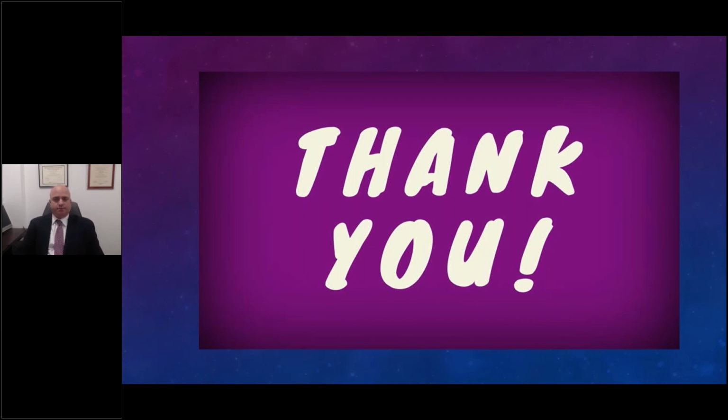Thank you. The next one is, do you have 25 millimeter available for full arch cases? At the moment, no, but I know that it's being worked upon. It's certainly something that is coming down the pipe. Keep in mind that for larger implant restorations, all-on-4 and all-on-X, you need that vertical dimension.